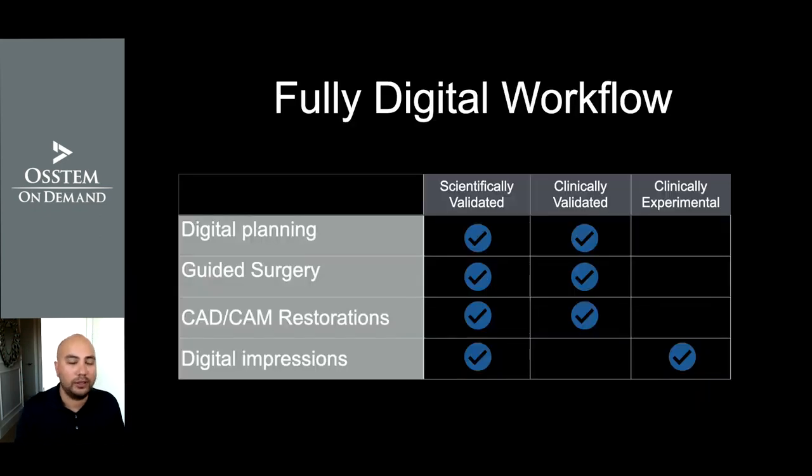Okay, so to conclude, are we there yet with a fully digital workflow? When it comes to digital planning, it is scientifically validated and clinically validated, same as in guided surgery. Now we have adequate and sufficient literature supporting that, and clinical experience. CAD/CAM restorations are also scientifically validated and clinically validated, whereas digital impressions are scientifically validated but only clinically experimental.